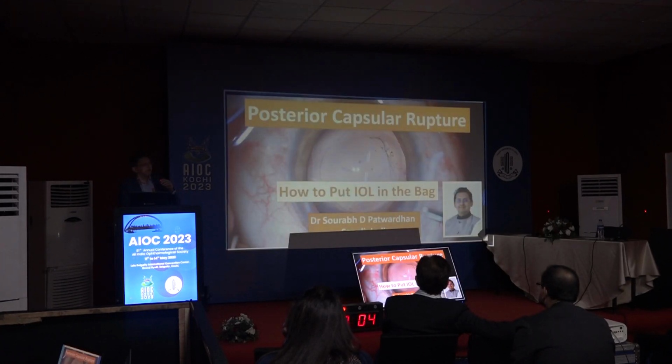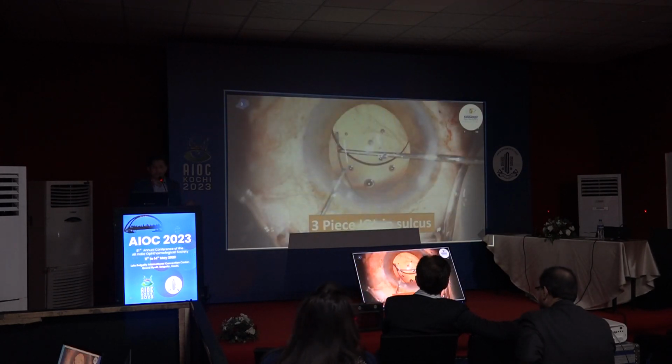Now the last part is, can you place the IOL inside the bag, after having a posterior capsular rupture?